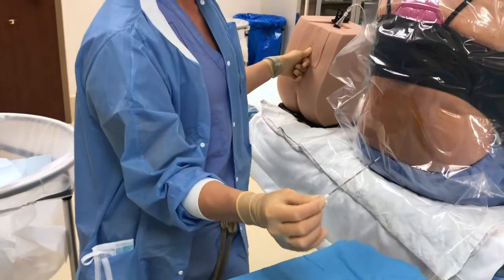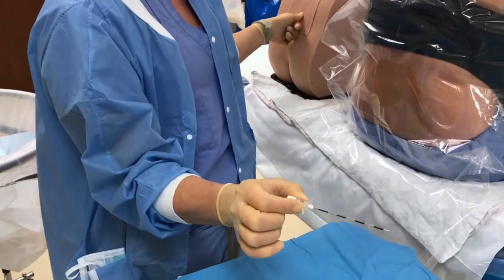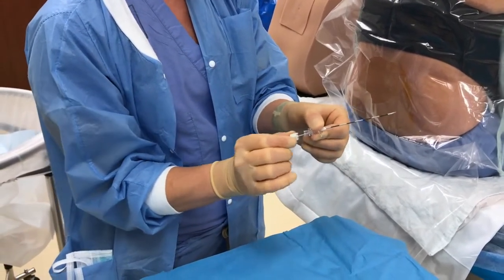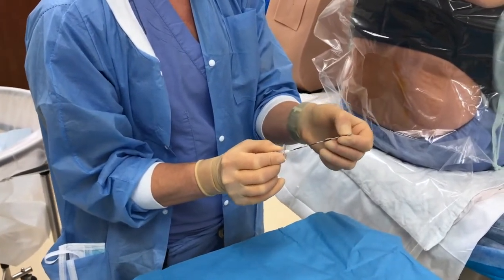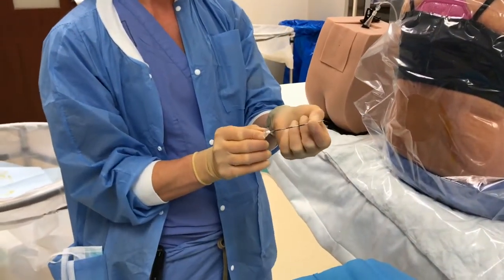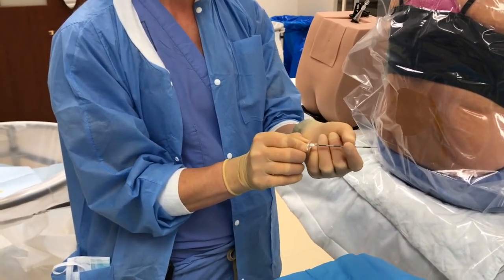The Tuohy needle, like I mentioned, is 9 centimeters in length. You want the bevel to be facing up, and that corresponds with this little divot, this plastic divot, so that you always want that to be upright. You want the stylet to be in place so that you're blocking any entrance of tissue or blood through the Tuohy needle. Like I said, each one of these is a centimeter, so be aware as you're introducing your Tuohy needle. Kind of be cautious and wary of your depth.